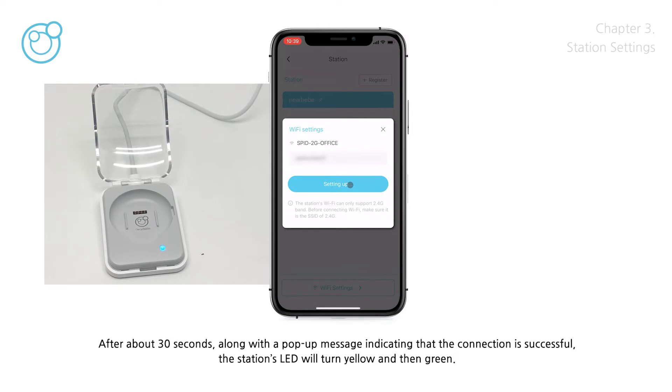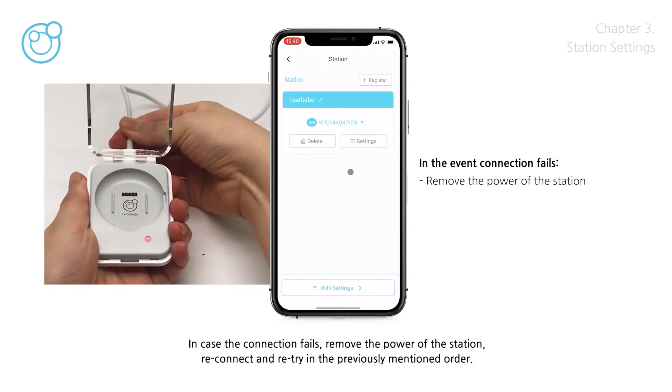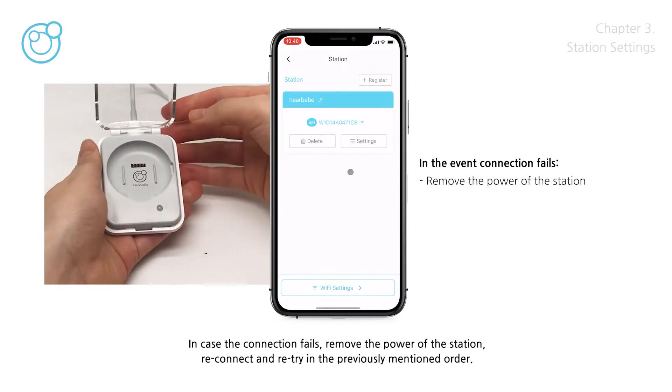After about 30 seconds, along with a pop-up message indicating that the connection is successful, the station's LED will turn yellow and then green. In case the connection fails, remove the power of the station, reconnect, and retry in the previously mentioned order.